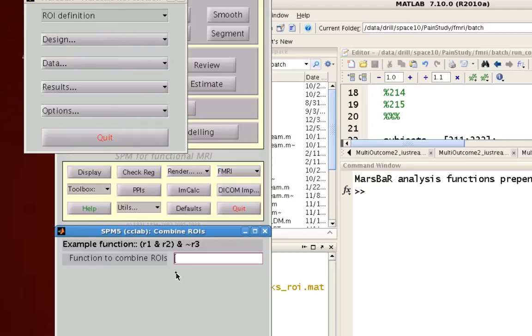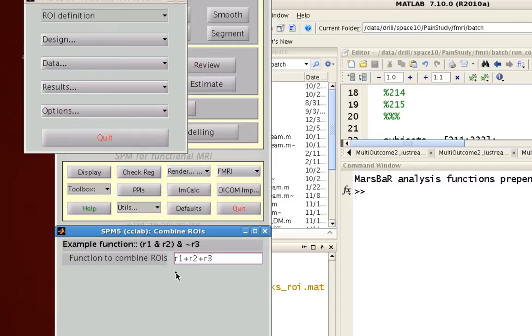If you had four ROIs, then there'd be R4 to represent the fourth ROI. In this case I just want to combine all of them, so I'm going to do a simple formula of R1 plus R2 plus R3.